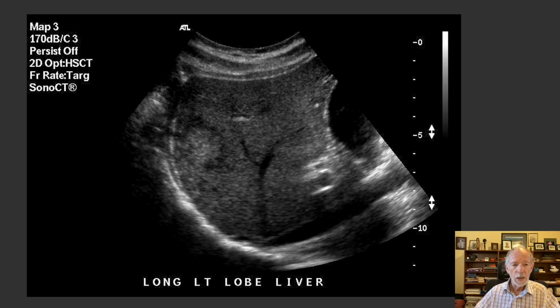This liver image is an example of soft tissue being imaged by virtue of the scattering from the fine structures within the soft tissue. So it's all the structures within the liver that are producing this speckled grey appearance, which we recognize as typical soft tissue appearance for an ultrasound image. Now, this random dot pattern of varying shades of grey is what is referred to as speckle.